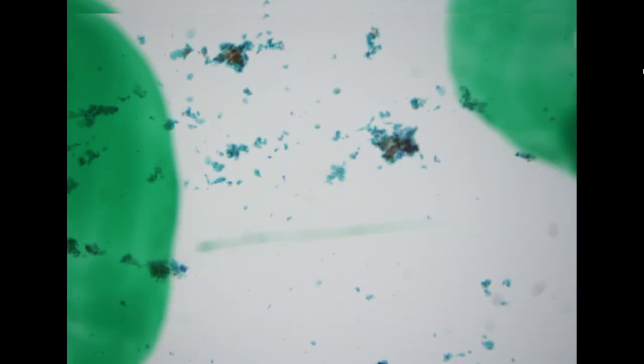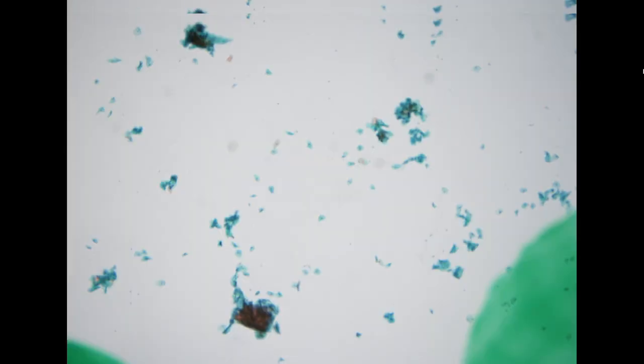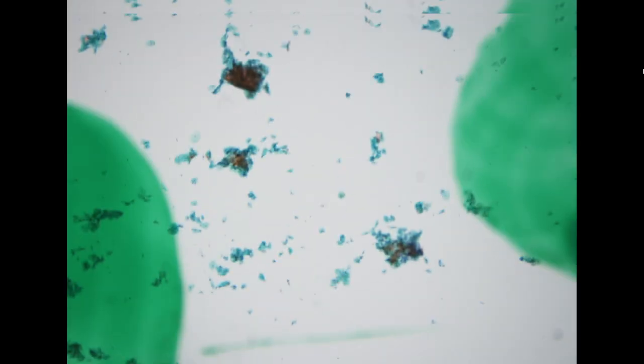A 61-year-old female who had a history of high-risk HPV infection had a smear at a hospital in China. So she came back to Taiwan and had a second smear here. At 61, she is probably already postmenopausal. On low power, we don't see a lot of superficial cells, mostly intermediate cells. Along the smearing direction, we have these dots.